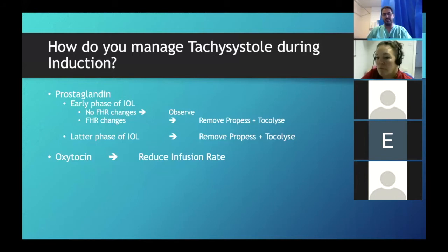because if it's just about a slight rise in baseline with a slight rise in core temperature, that settles with paracetamol, and this baby is showing absolutely no other signs apart from a slightly faster heart rate, this is not necessarily chorioamnionitis. This is the core temperature going up with prostaglandins. You can bring it down with paracetamol. I mean, temperature is damaging within itself. So babies get damaged by the temperature.